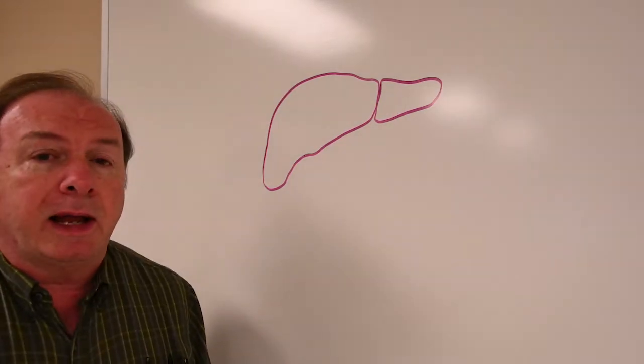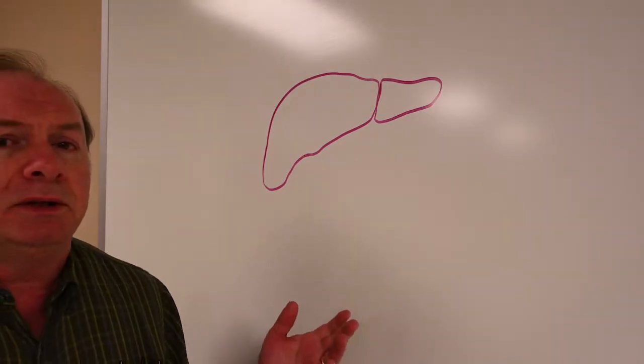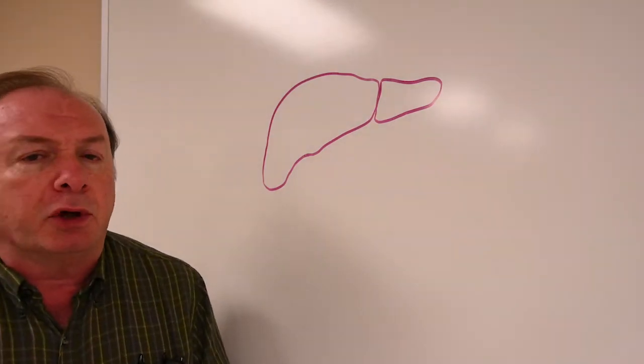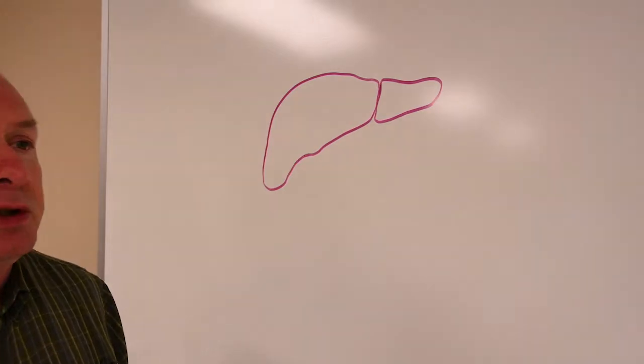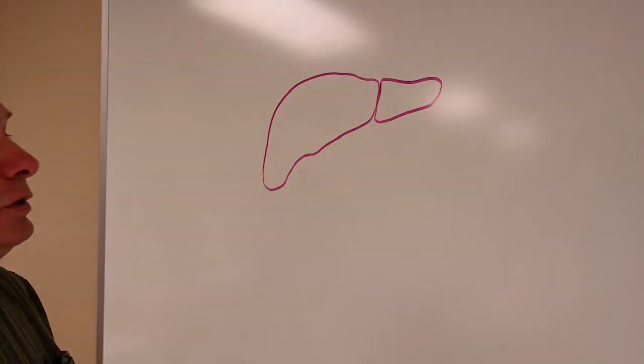We're going to do our liver lab material today, and we're going to begin with just a few drawings here on the board, and then we'll go to the microscope and we'll show you those images from the microscope up on the screen, on the television screen.